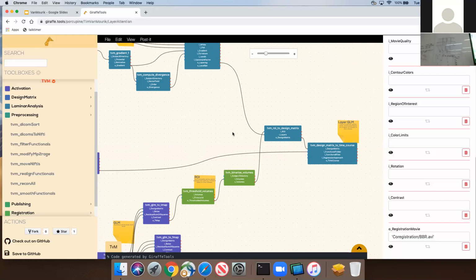You're amplifying the noise more than you're extracting the signal. I find it hard to explain adequately, but as you can imagine, all these regressors are very correlated because one voxel here already is spread over 4 layers.